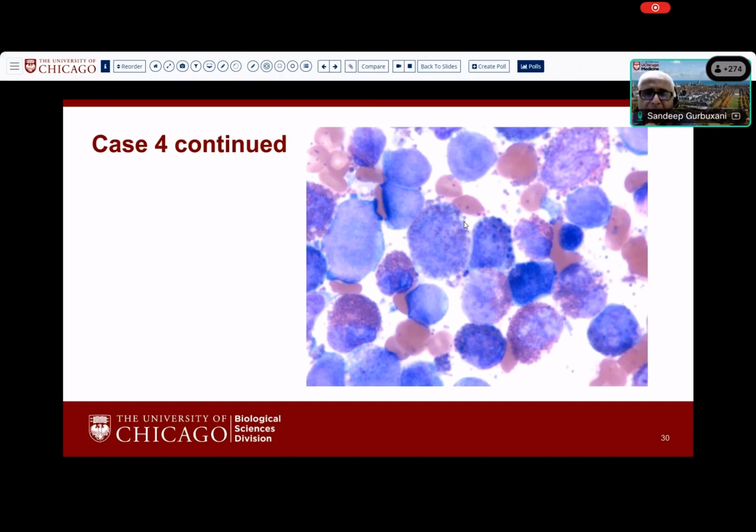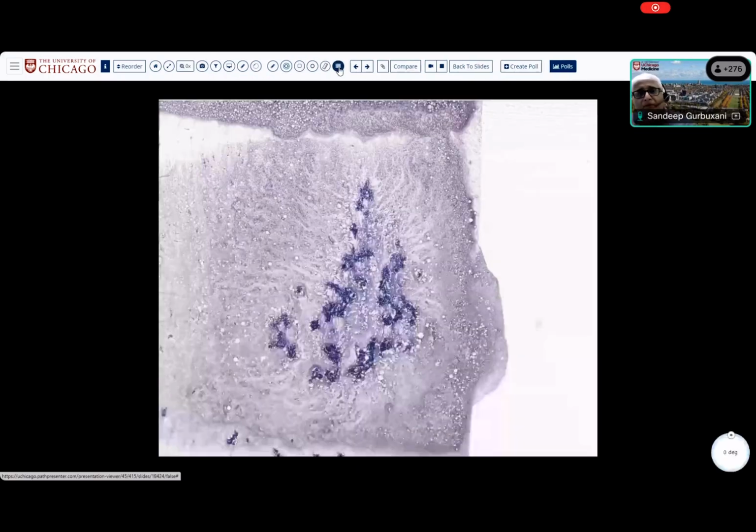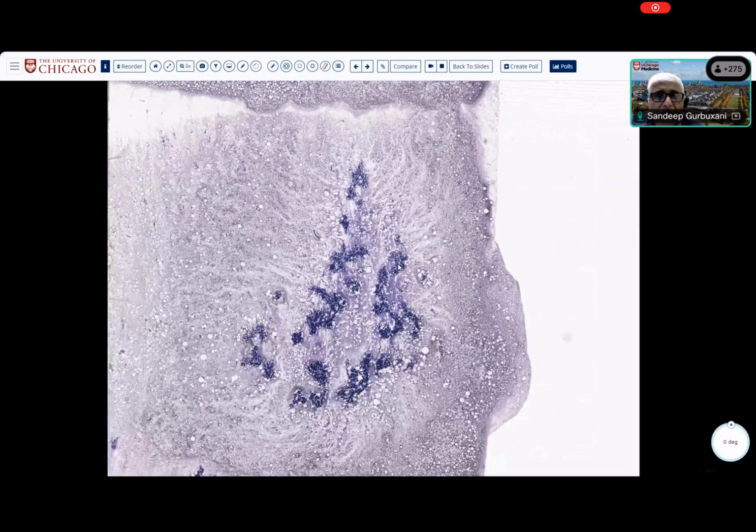So excellent. This is an acute myeloid leukemia with inversion 16, a translocation that results in generation of a fusion protein of core binding factor beta, a transcription factor involved in neutrophil maturation, and MYH11. It is one of the genetically defined entities in the WHO and the ICC that is characterized by the presence of these abnormal eosinophils. The abnormal eosinophils are rare. This case has a particularly high number of eosinophils. Sometimes the eosinophils are not as prominent, but if you spend some time looking at your slides, you will find these abnormal eosinophils. So moving on, and we are almost at the end.